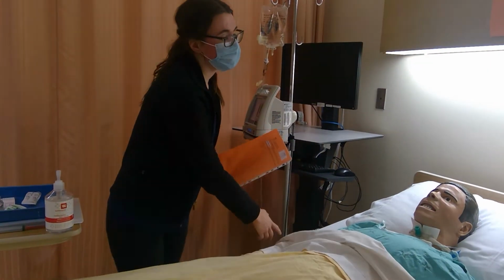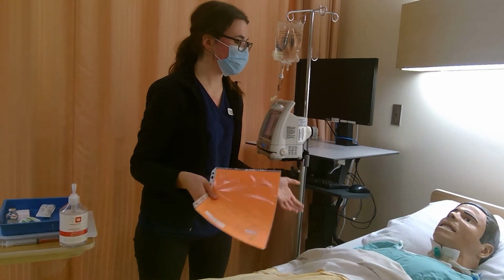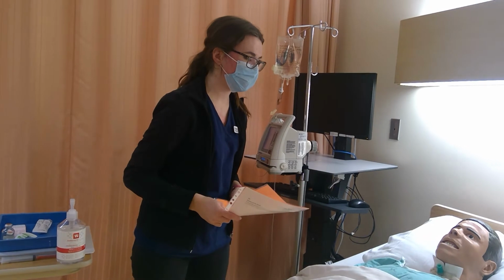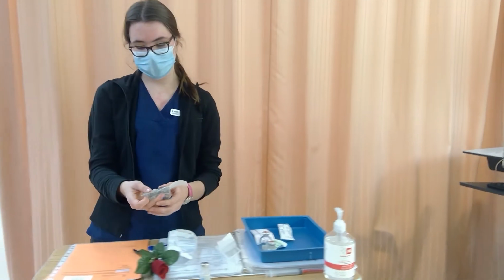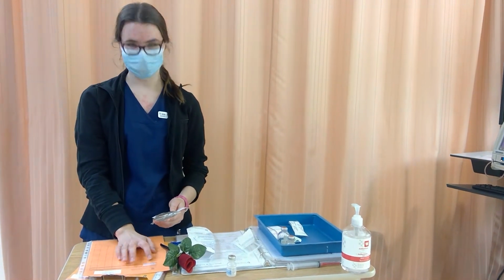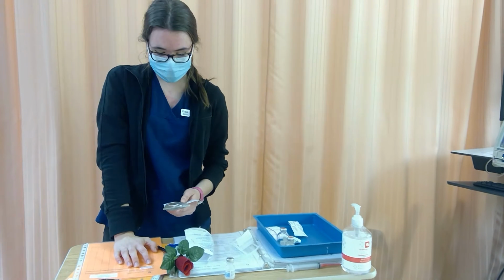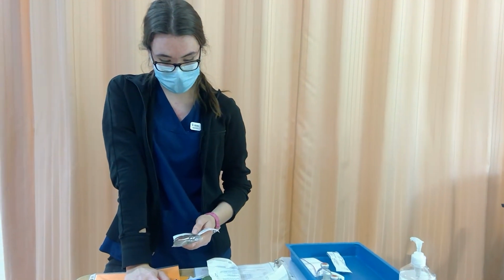And so Valdez, I'm just going to do my final check of the medications up here, and then I'm going to come back to you and kind of explain what I'm giving to you. Okay, Valdez? Thank you. So I'm going to go up here, and I'm going to take my medication, and I'm just going to see I have the correct patient. Valdez Vox. That always makes me giggle. My correct drug is penicillin. My correct dose is 2.5 million units.